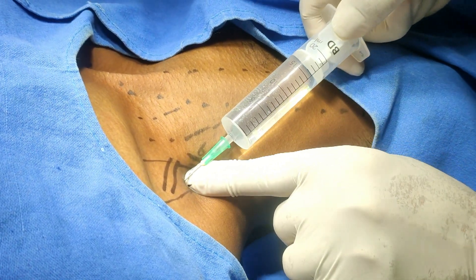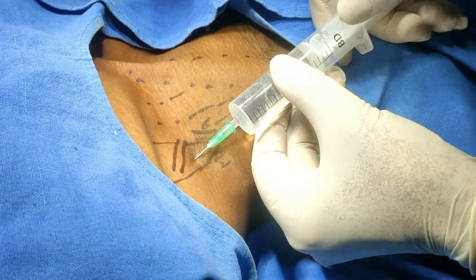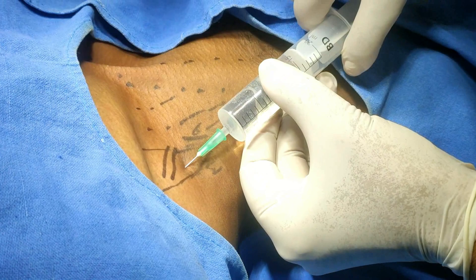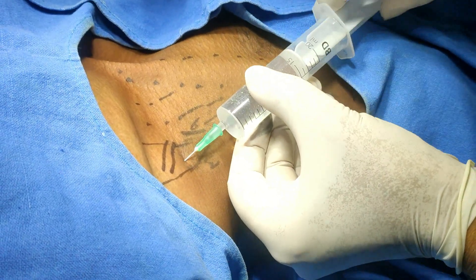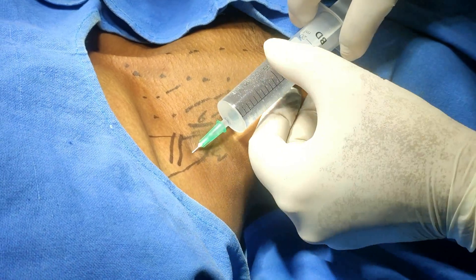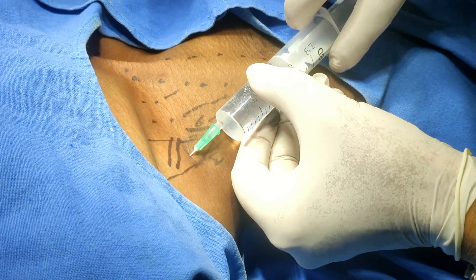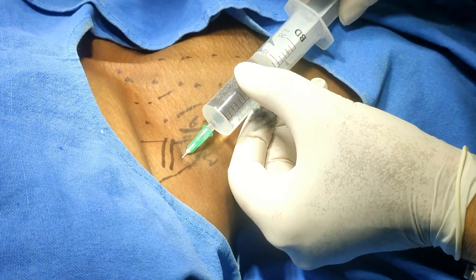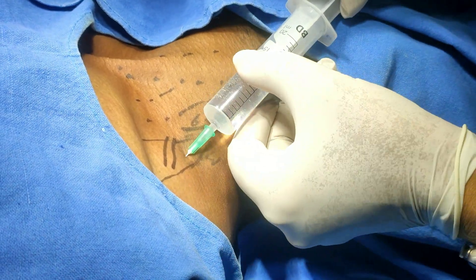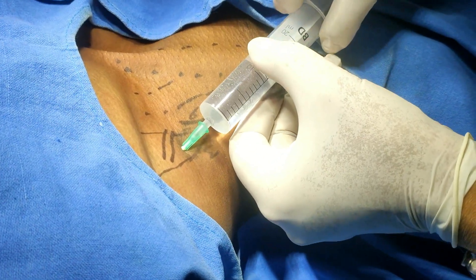Just advance the needle, aspirate, and advance gradually — move in a deeper plane, advance, aspirate and advance. There should not be any blood here.